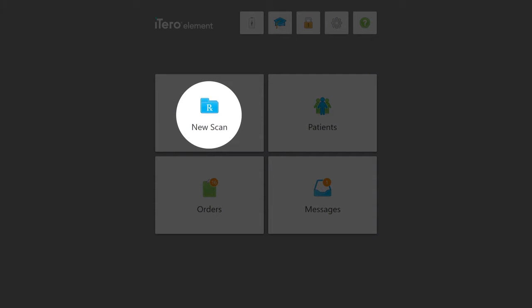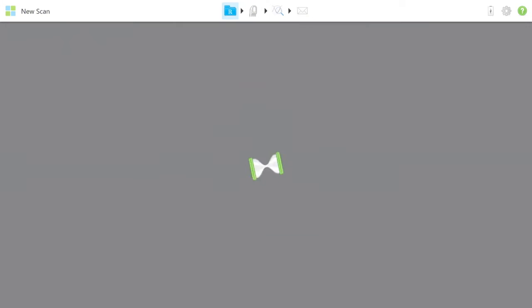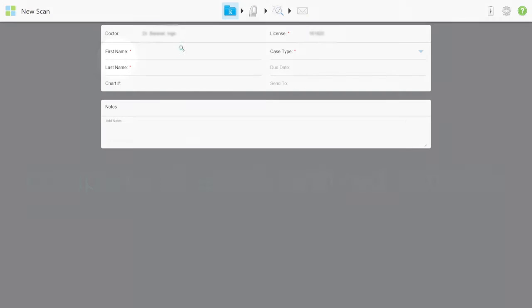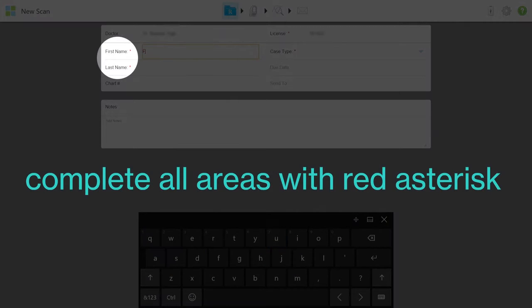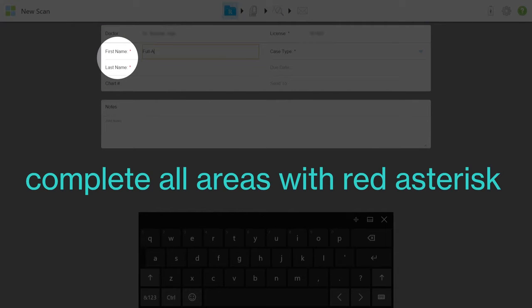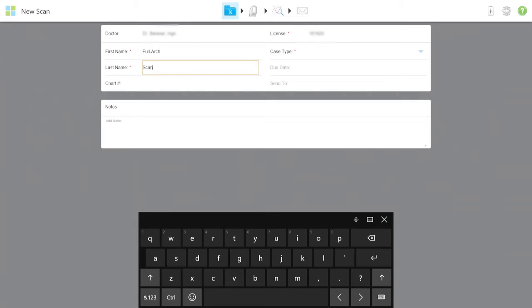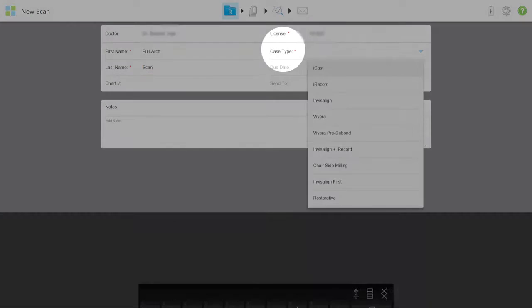To begin, select the new case icon from the home screen, enter the required information in the patient RX, and choose the case type from the drop-down menu.